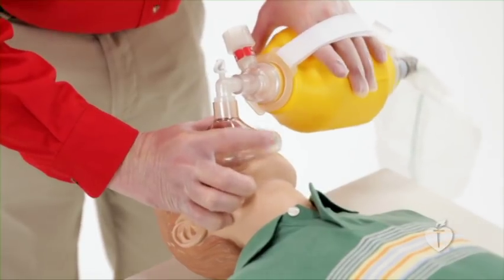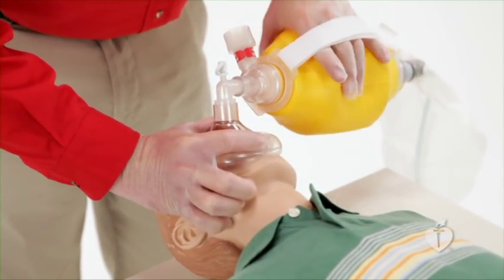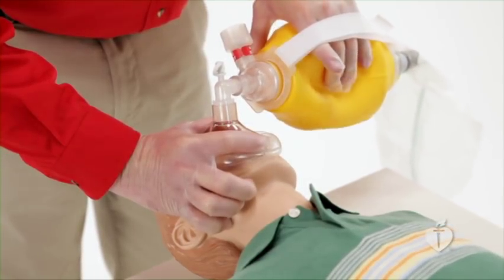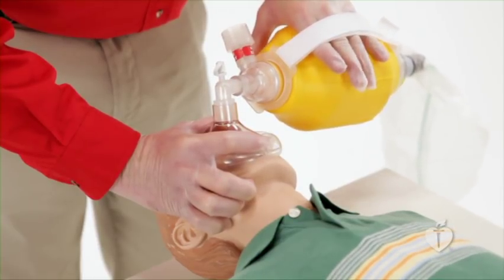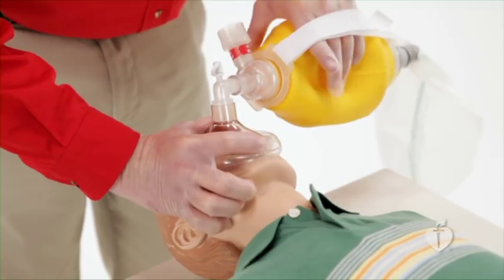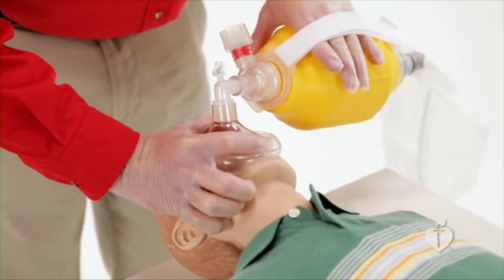If you tilt or extend a child's head beyond the neutral position, the airway may become blocked. Make sure you hold the mask against the face with your thumb and index finger while using the remaining fingers of that hand to lift the jaw and open the airway. Make sure you make a tight seal between the mask and the child's face. Squeeze the bag with your other hand to deliver just enough breath to make the chest rise.